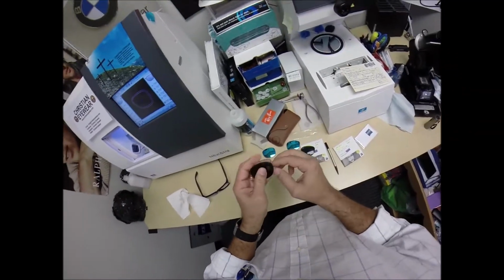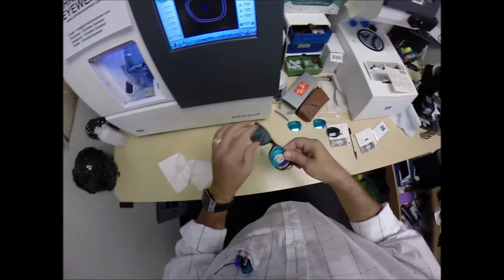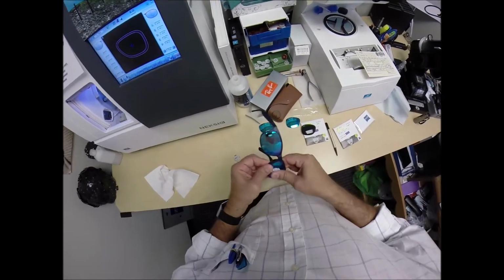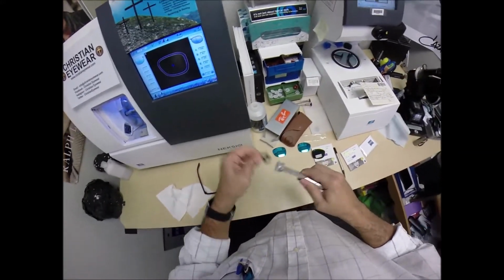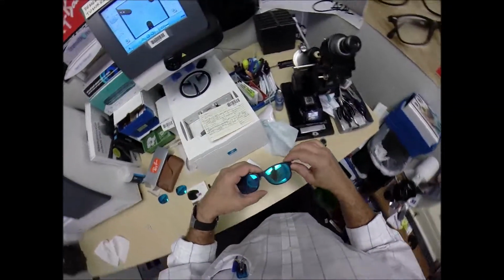Make sure all the optical sawdust is off the edge of the lens. See if this fits, or if I need to take it down some more. Tuck it in at the outside corner, push down with my thumbs, and it snaps right in. We can go ahead and take this block off, pull the sticker away, dry that off, add to my sticker collection, and come down here to the lensometer.